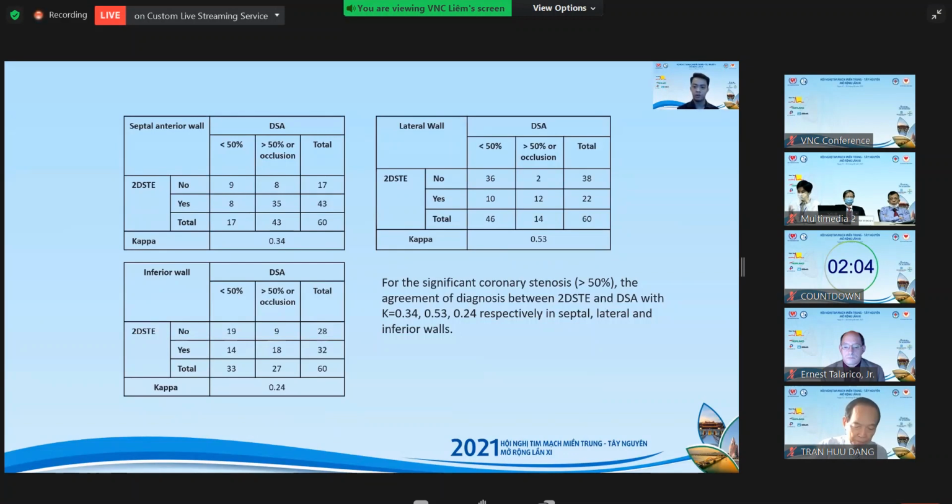We found that the agreement between 2D STE and angiography is not good with the endocardial setting of QLAB software to identify the segmental motion abnormalities. Abnormalities clearly viewed in 2D echocardiography may not be recognized on the endocardial 2D STE. The epicardial strain analysis may resolve this problem in these cases if we change the layer setting of the software.